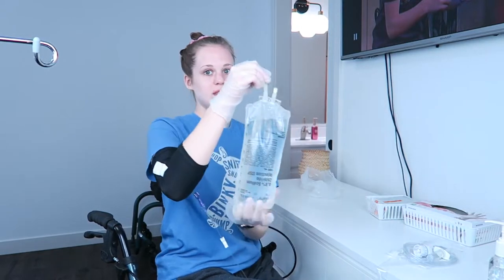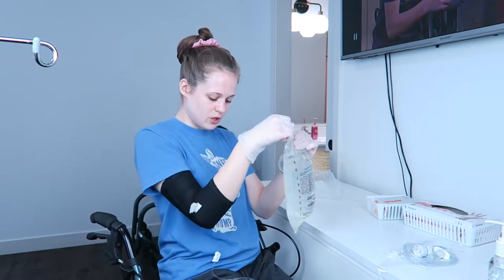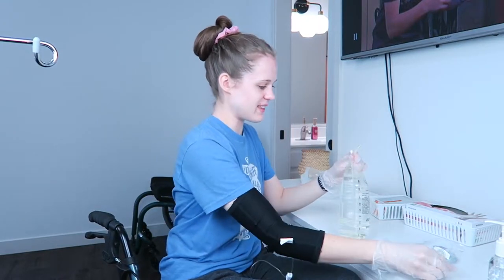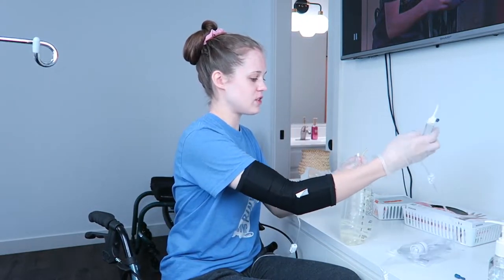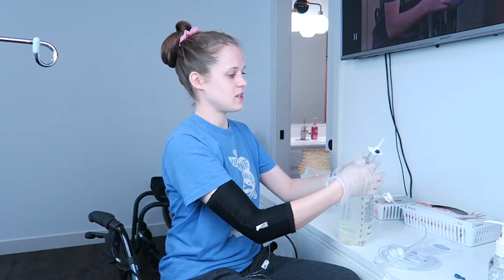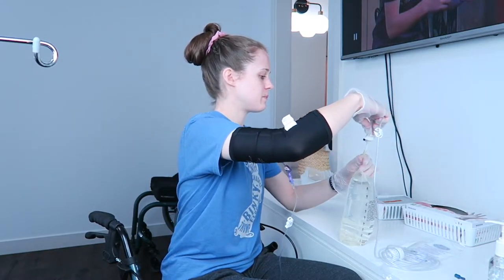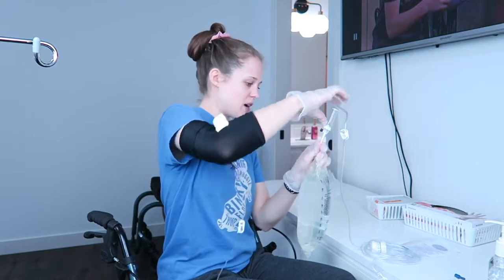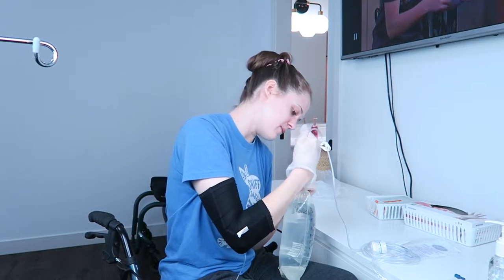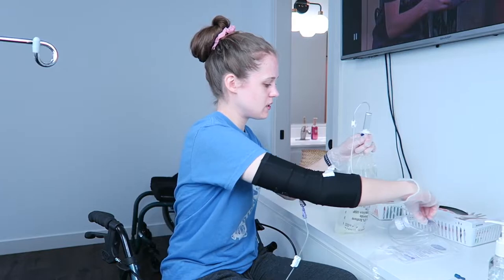Next, you take the bag of fluids, and with mine, it has this little blue tip here, and I'm just gonna pull that off like that. Then I'm gonna take the end of the tubing, which is this thing, take off the cap, and stick it in. And then you just push down until it is in all the way. And then I'm gonna go ahead and clamp it.